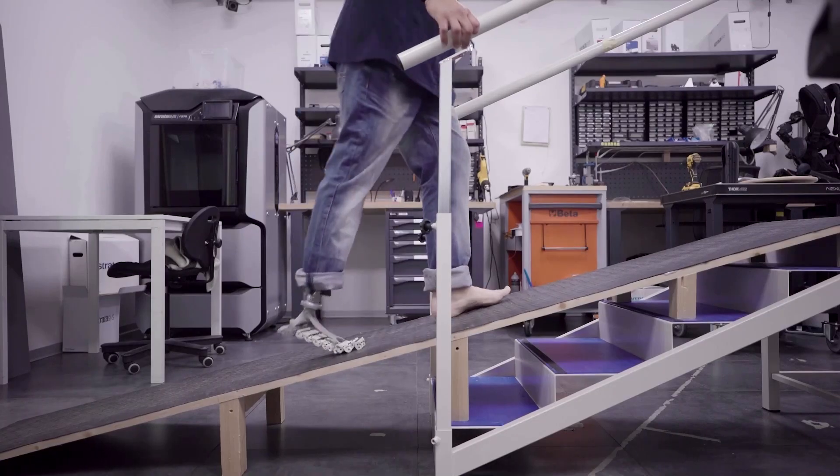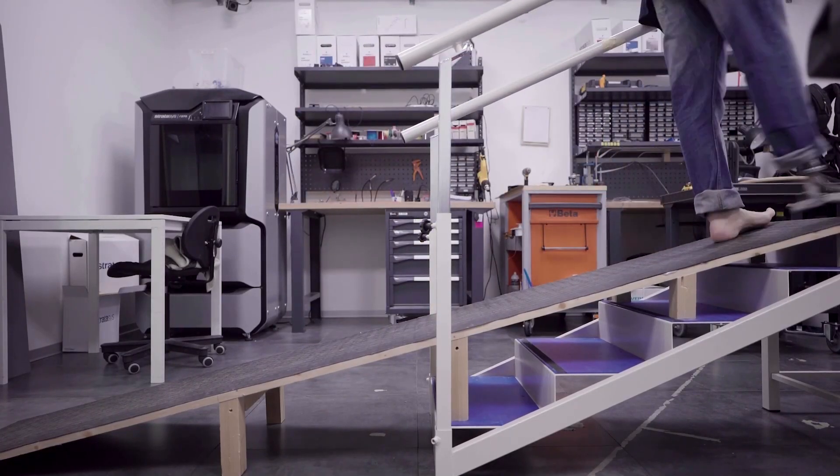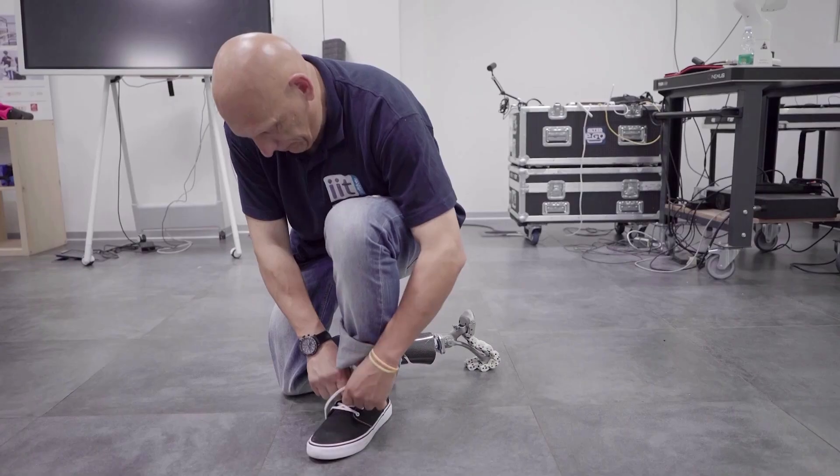Catalano says that current prosthetics have flat or low-compliant feet, meaning they aren't able to adapt to changes in terrain or posture.